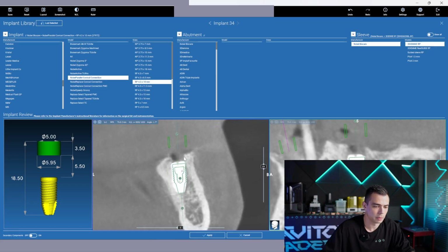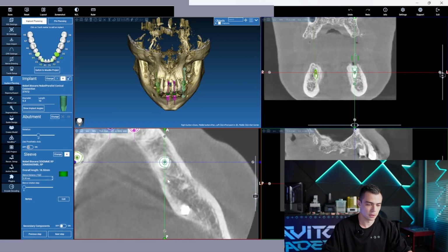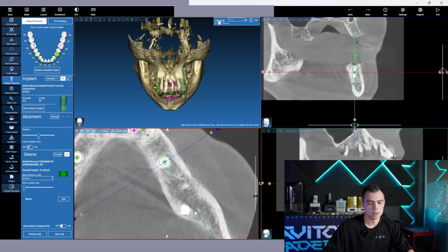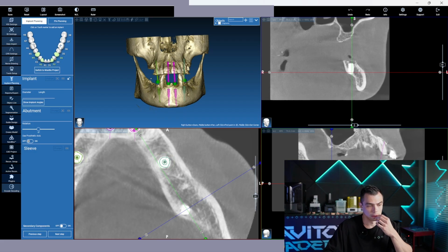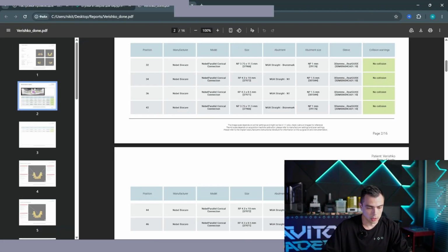The main probable drawback of this technique is that everything relies on your manual placement, but once again, this is just a way to understand whether it was successful or not. I mean, the whole surgery.